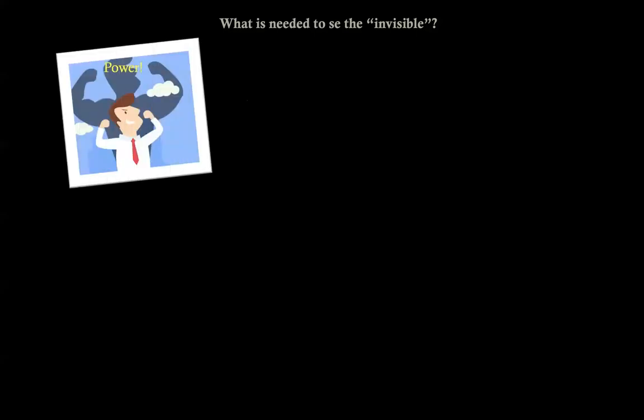And power in MR means high field. So if you have a 1.5 or 3 Tesla scanner, you should use it because this will allow a better signal to noise ratio, especially the 3 Tesla, which is the gold standard in the Western world at least. But you need to be aware of a lot of pitfalls.